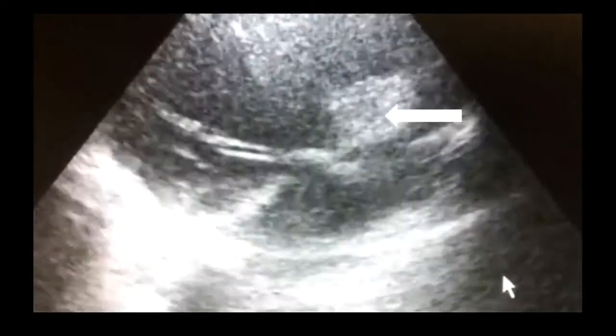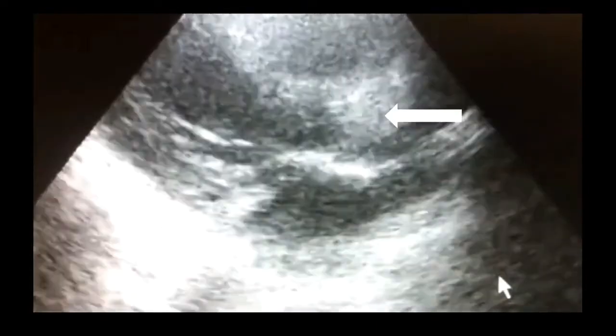This is another example of aortic dissection, in which the blood between the intima and the media, the blood under the intima flap, is thrombosed, and that's why it looks white, bright, and echogenic in this case.